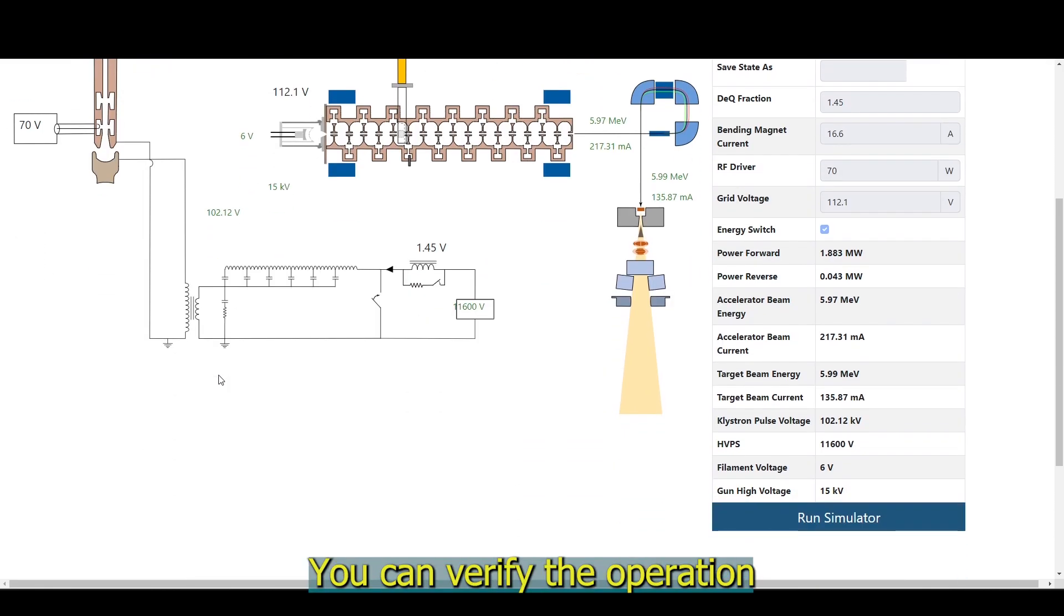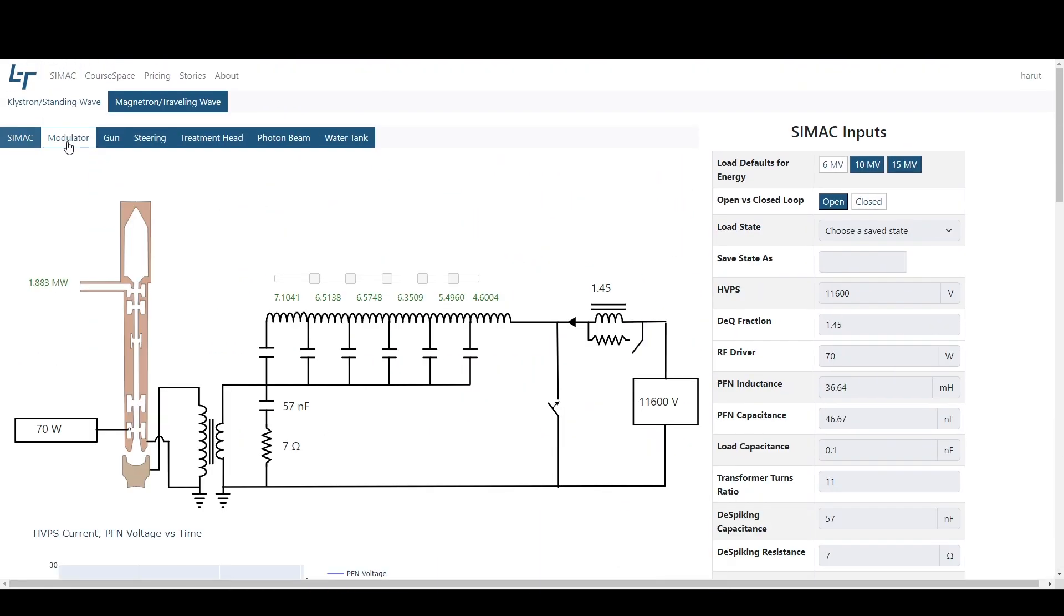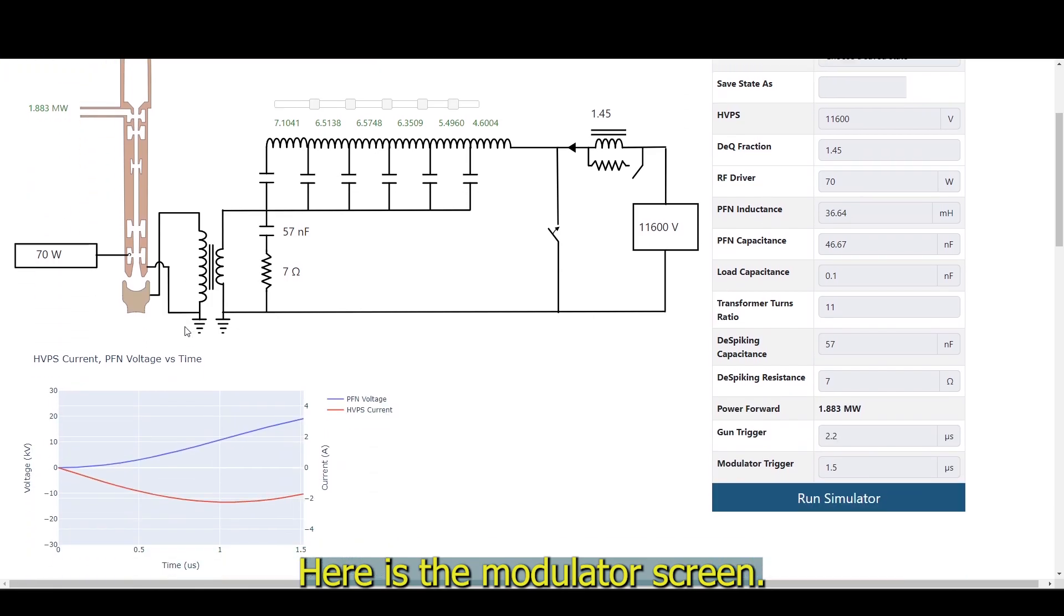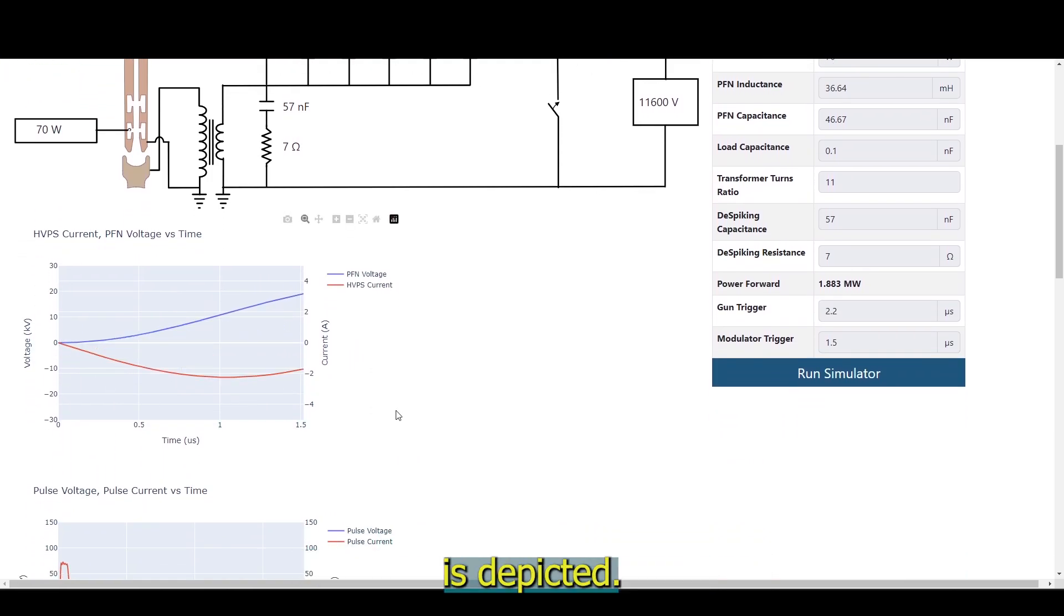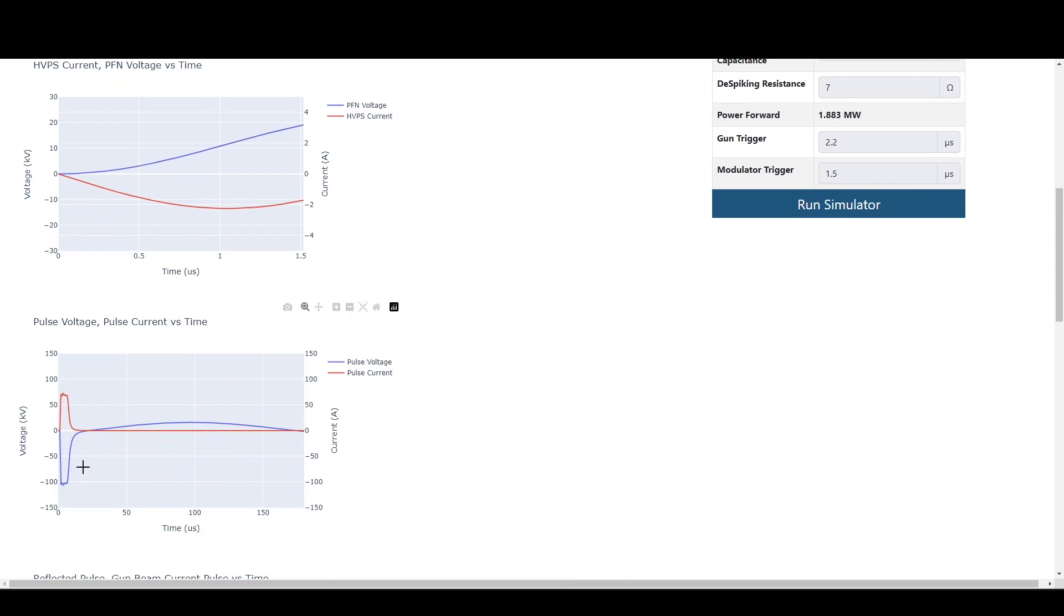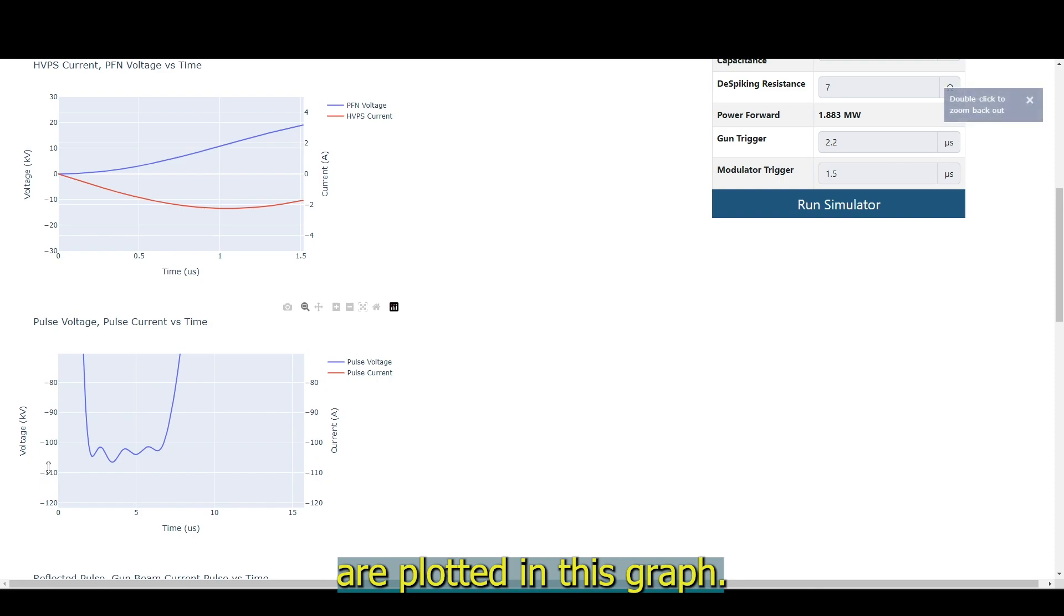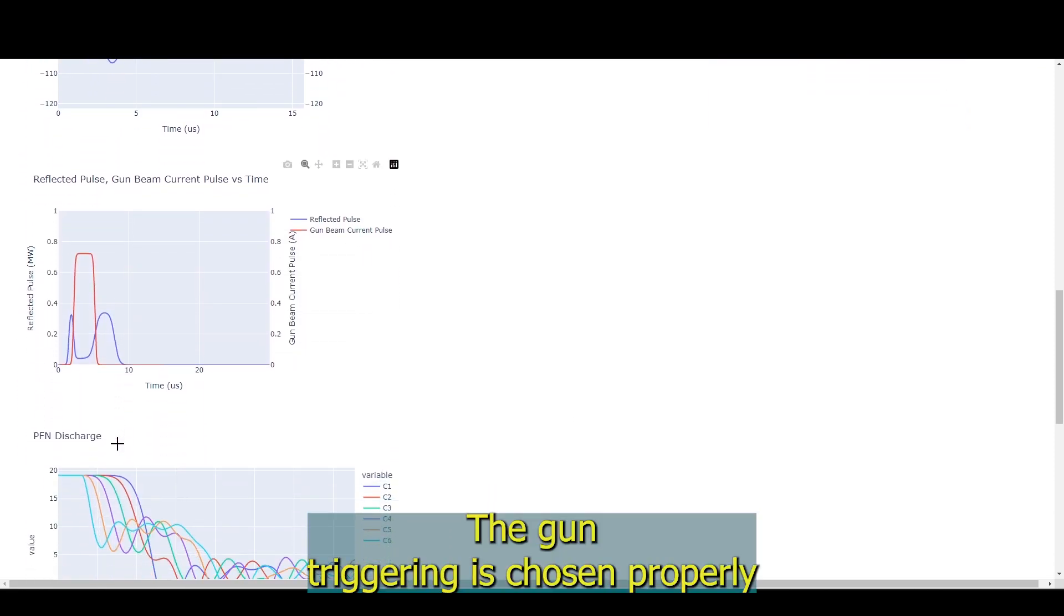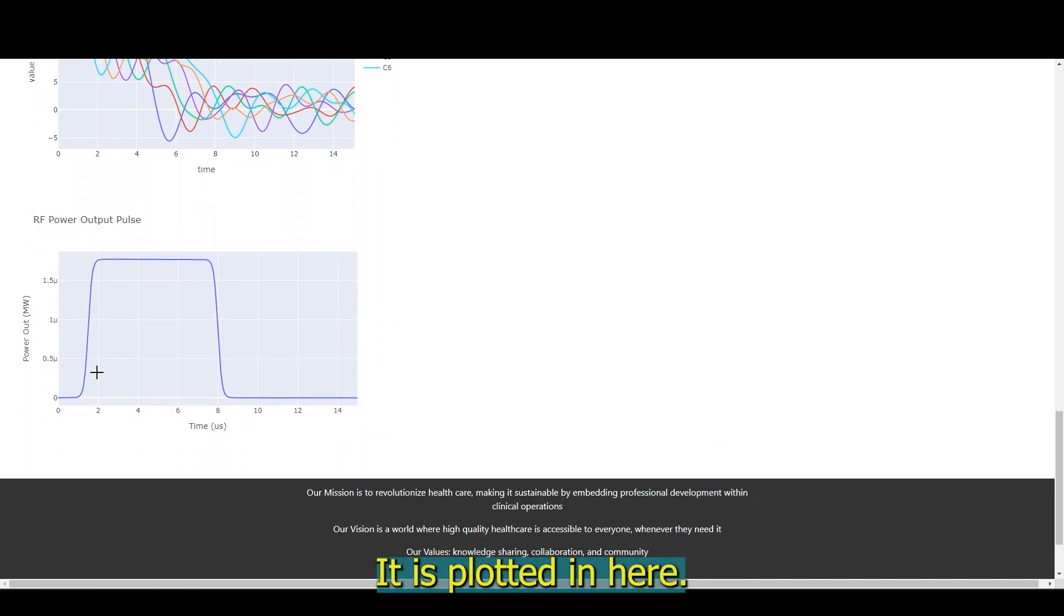You can verify the operation by looking at the graphs that are generated. Here is the modulator screen. The PRF charging cycle is depicted. The generated voltage pulses are plotted in this graph. The gun triggering is chosen properly and the output power looks okay. It is plotted in here.